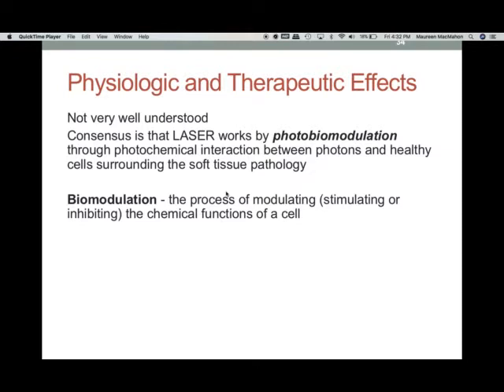Okay, so the actual physiologic and therapeutic effects of laser are not terribly well understood, but the consensus is that laser works by photobiomodulation. Okay, and we just saw that in the previous slide. So we'll talk about what photobiomodulation is and what its effects are. And really what happens is that there are photochemical interactions between the photons going into the tissues and the healthy cells that are surrounding the tissue that is affected by the pathology.